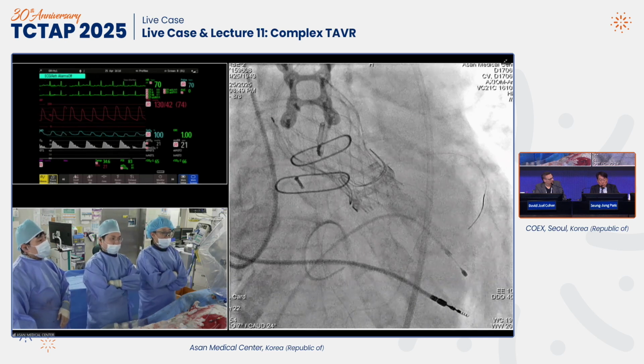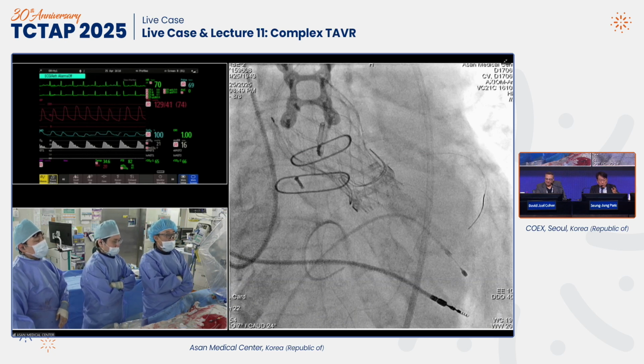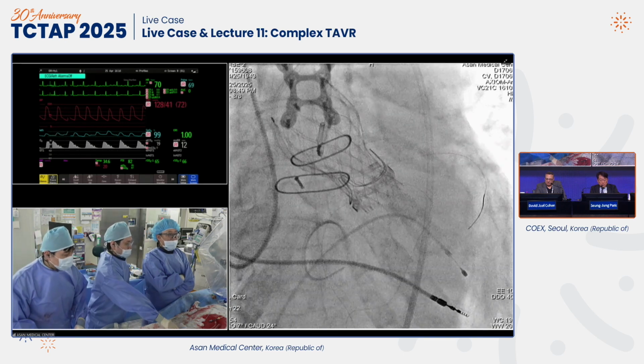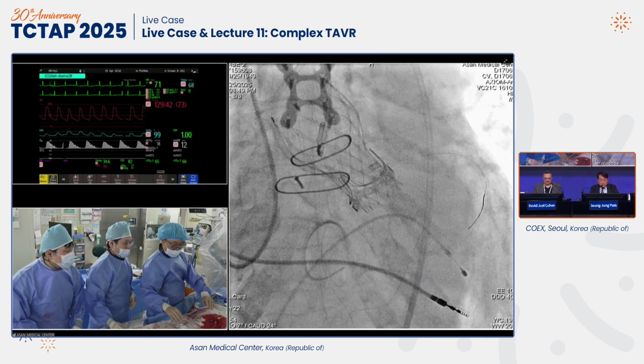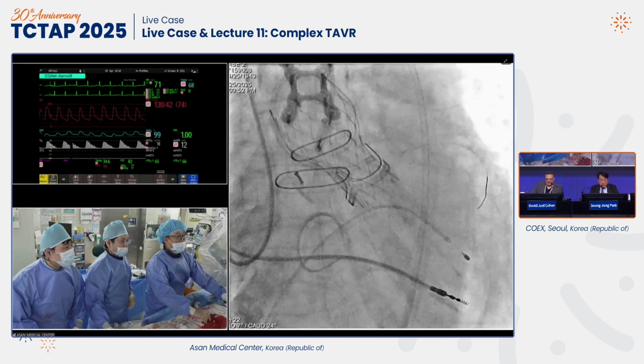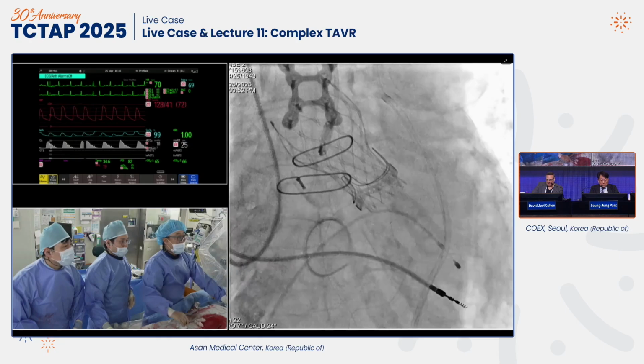All right. So Doug, after we remove the coronary catheter, finally we need an aortogram. Absolutely. Yeah. Okay, we want to see that. What's happened? Okay. So after this, we remove the guide catheter. Okay, then, perfect.